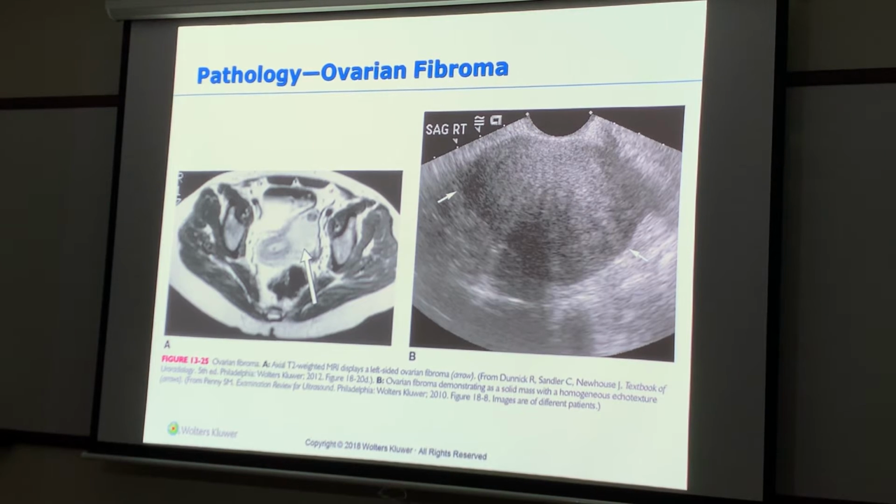And I've already done my uterus. If I'm at my ovary, I've already done my uterus. I know there's no pathology with the uterus. So it depends on if I angle to the right or if I angle to the left. Got it? Okay.